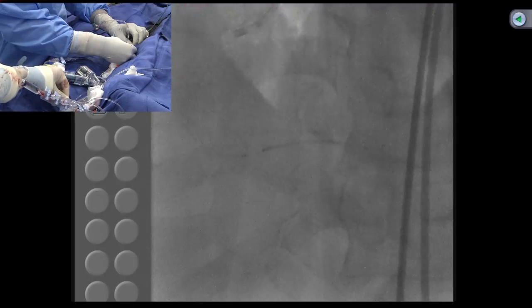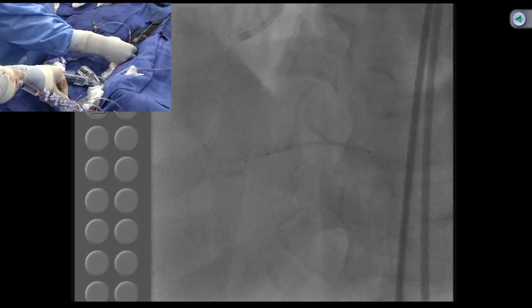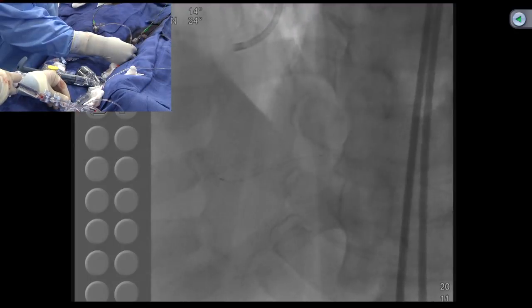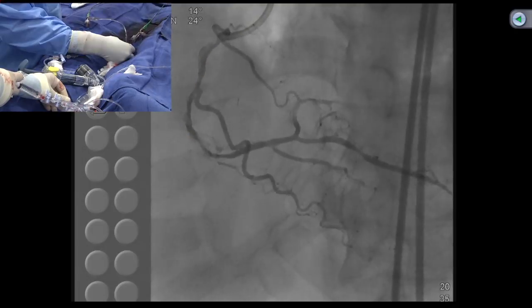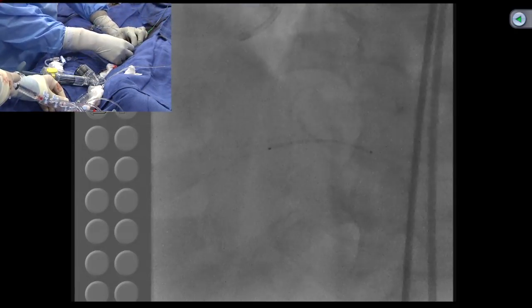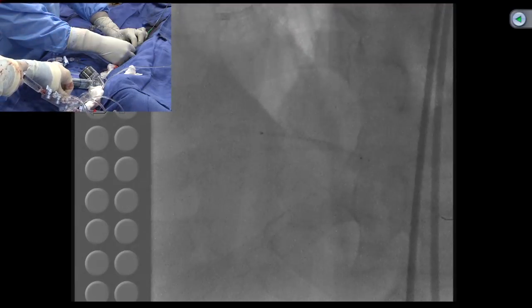There's disease at the... okay, but then I go a little further and we'll put one proximally. If we require, good, one extra. Okay. Just at the bifurcation, right. It's covering whatever we want. No, it's not covering completely. You need to go a little further. Remember, you have to go for PDA coverage. Proximally, we'll put another 2 stent probably.